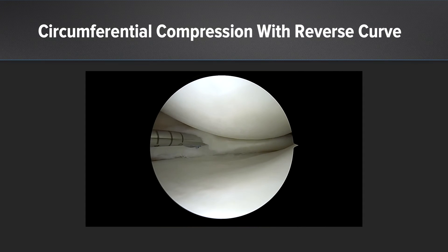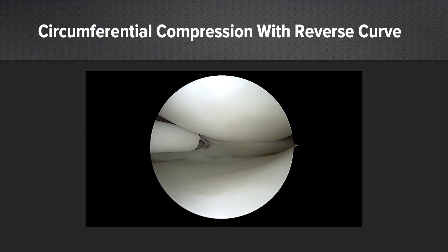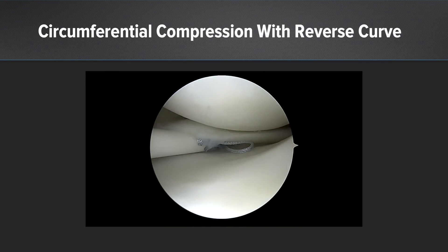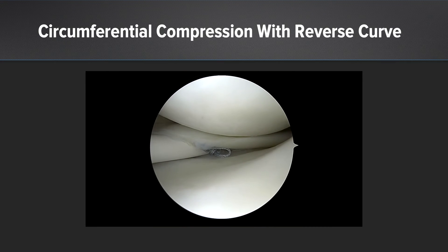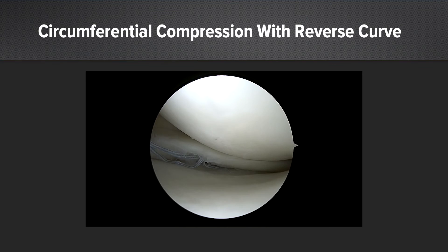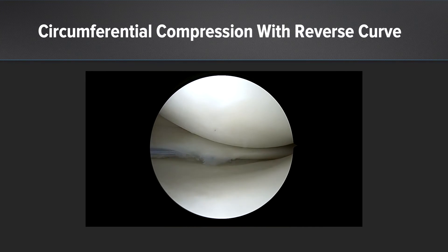Now what we need is circumferential compression. I need to be able to reach the tibial surface of the meniscus, and the reverse curve here is a perfect tool for me to do that. We're going to continue with vertical mattress sutures, easily perforating the inferior part of the meniscus and then the capsule. You can see when we're tensioning, there is reduction of the gap on the backside of the meniscus, really getting that anatomic recreation that we want.